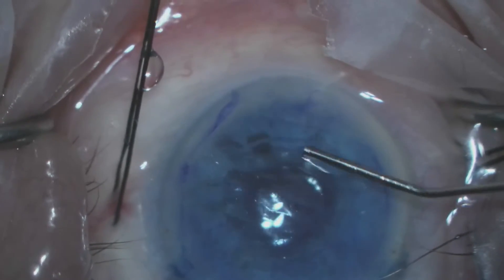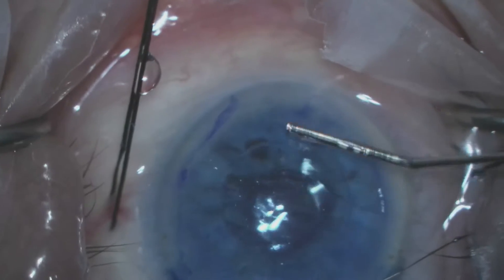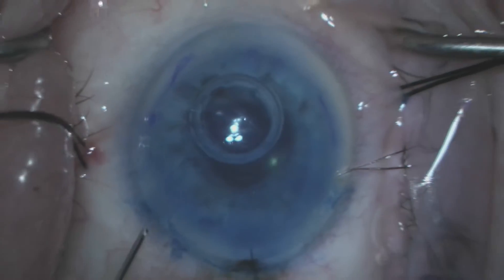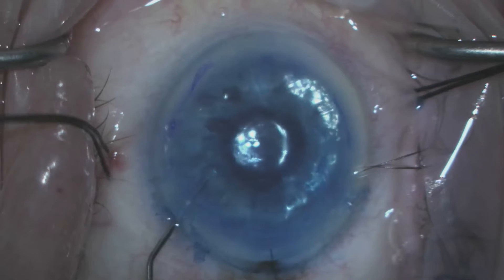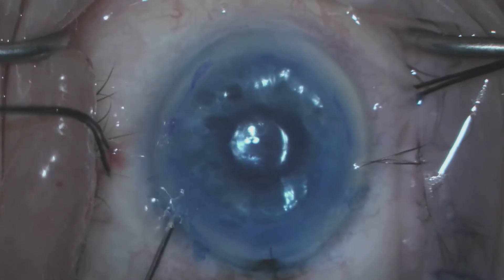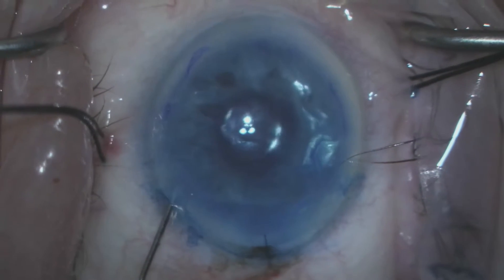Once we've confirmed that the donor Descemet's membrane and endothelium is correctly oriented, centered, and in proper position, we fill the anterior chamber with air and this pushes the donor layer adjacent to the patient's own posterior stroma.